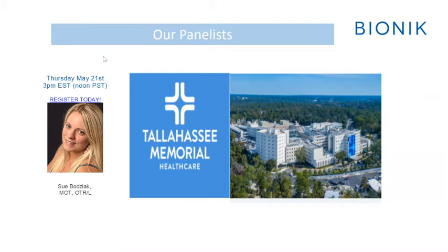Sure. So in the setup of the device, there are two different size circles. One is a 10 centimeter radius. The other is a 14 centimeter radius. And what this allows us to do is to tailor the program specifically to a patient. So if somebody is struggling with achieving the 14 centimeters, one of the things that we know from research in particular is that if you can get somebody to an 80% success rate, they actually learn faster. And so one of the things that we like to be able to do is to not only challenge our patients, but also help them succeed.